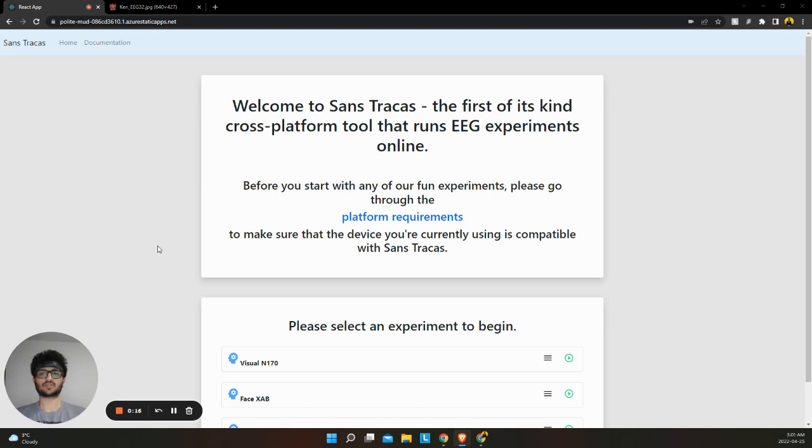Hello and welcome to Sans Tracas, the first of its kind cross-platform tool that allows anyone to participate in EEG experiments online. In this video, I will guide you through the steps involved in the study.